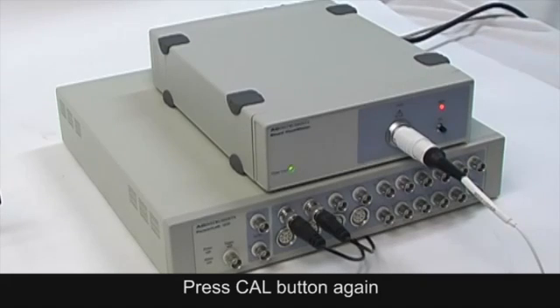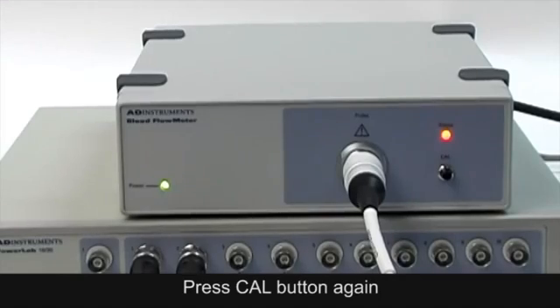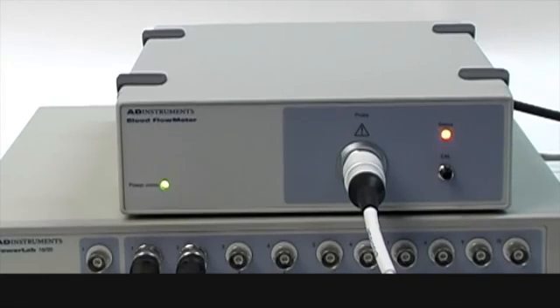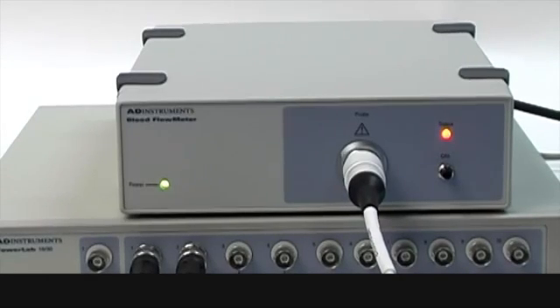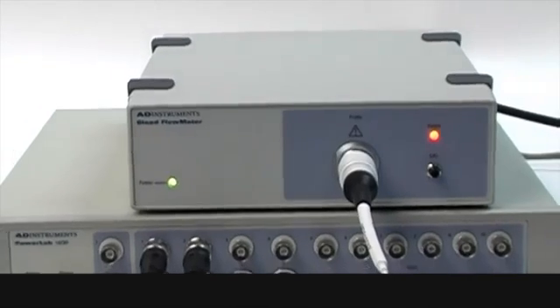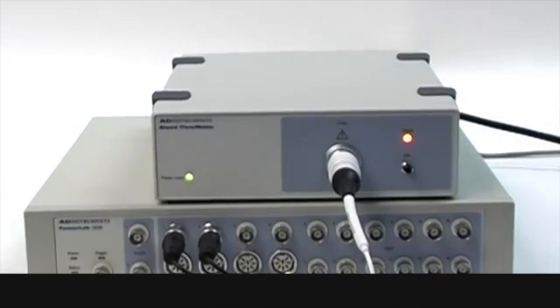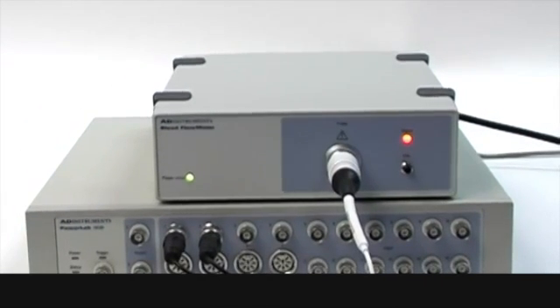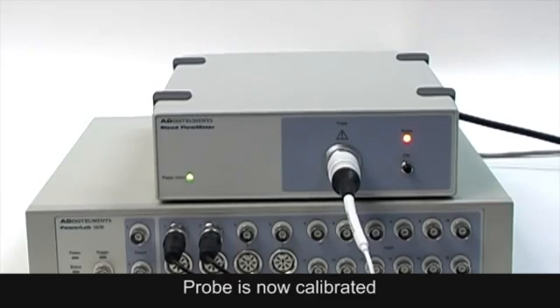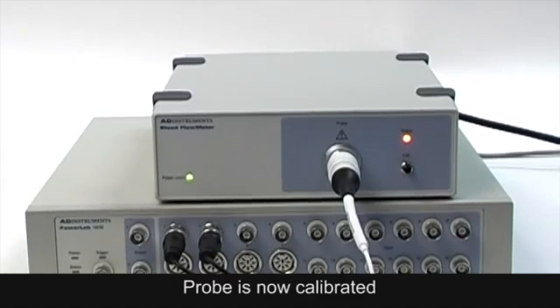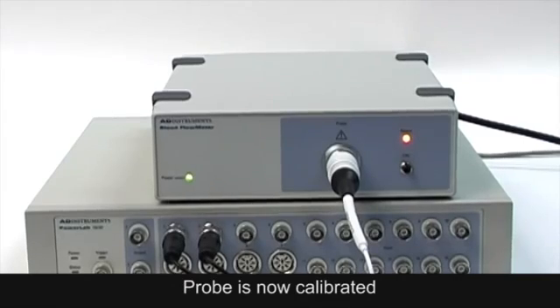A long beep will sound, and the indicator light on the front panel will alternately flash red and amber. After about 20 seconds, a double beep will sound to indicate the end of the calibration. The red indicator light will return to amber color. The probe is now calibrated and ready for use with the ML191.